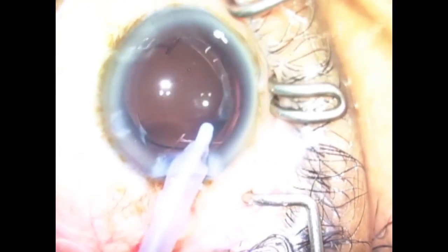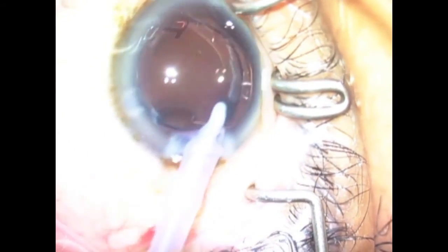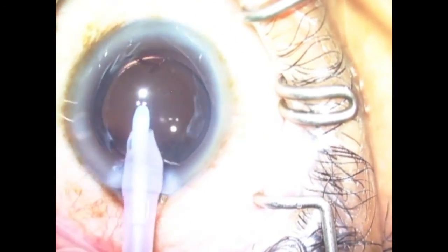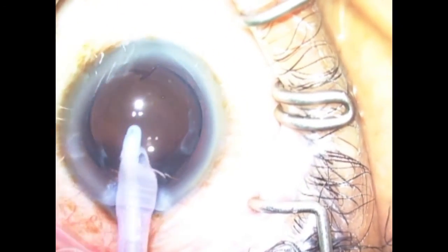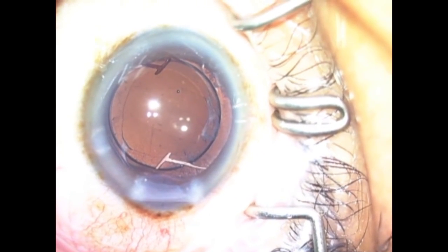Step 8. Viscoelastic is now aspirated from the eye. Step 9. At the end of the procedure, the intraocular lens is well centered within the capsular bag.